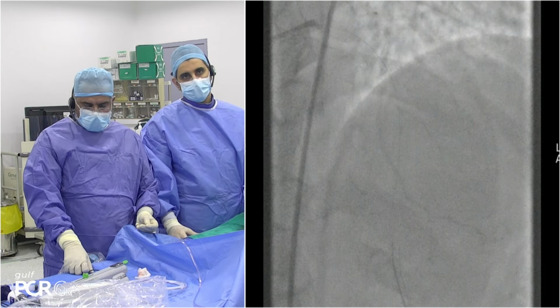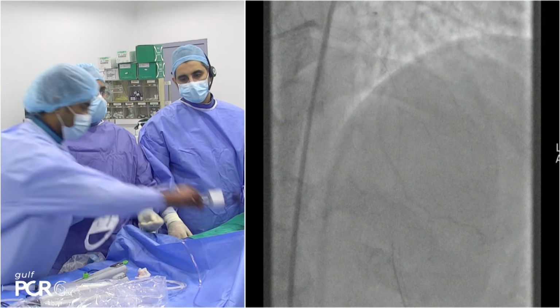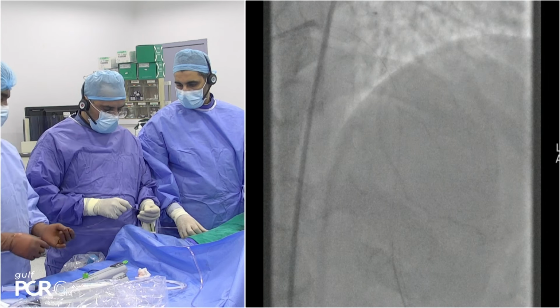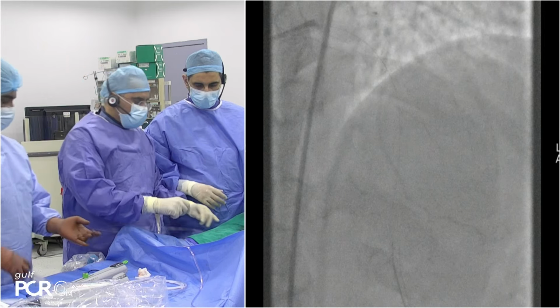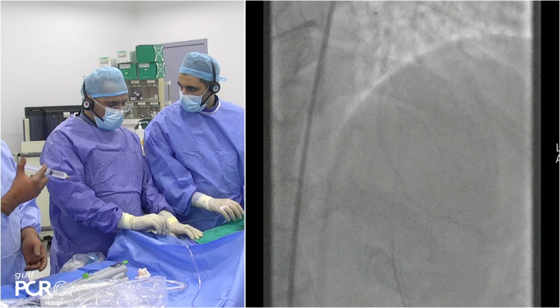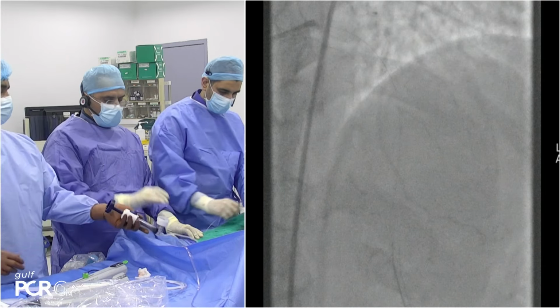We still have a huge amount of calcium. We are learning how to treat the calcium because we are starting to see, but we are very far, and it's quite difficult to implant a stent at this point without doing any additional lesion preparation. Which one could it be? Well, we needed to remove more calcium or to have a much bigger impact. We saw, for instance, that IVL in this case might also function because you have calcium on opposite sides. So I think the fracture here was quite limited. So I don't want to go with a stent at this point. I wanted to do something in addition.